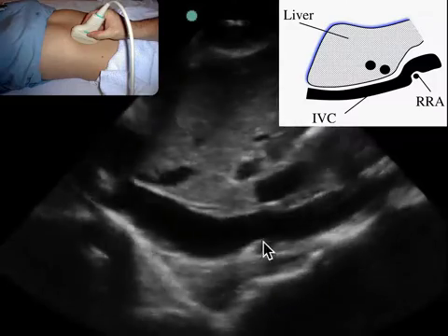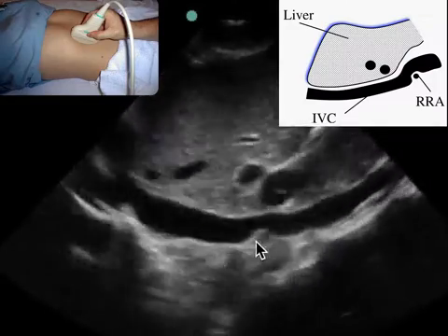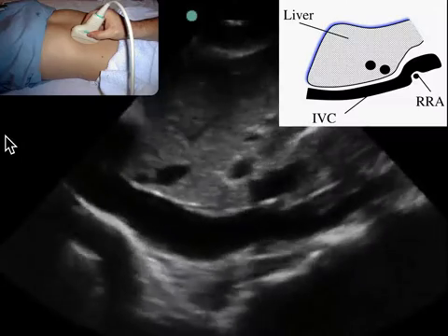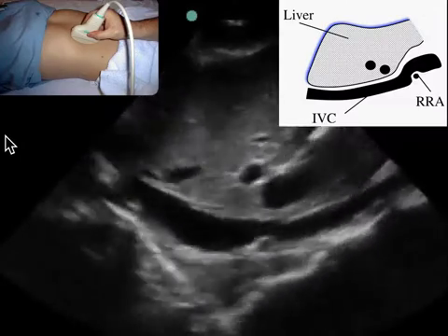Once in a while it pokes its little nose into the IVC. It runs posterior but perpendicular to the IVC. This is the right renal artery seen down here. That confirms I'm definitely looking at the IVC and not the aorta. Sometimes the IVC and the aorta in a sagittal plane, hard to tell them apart because you don't see them both at the same time.